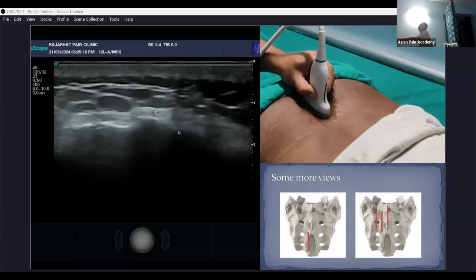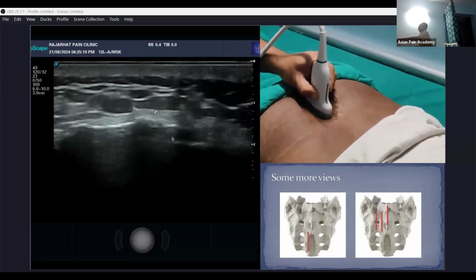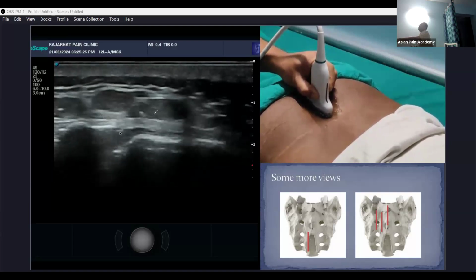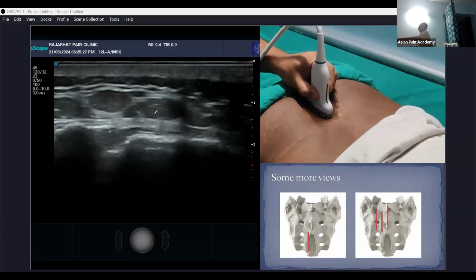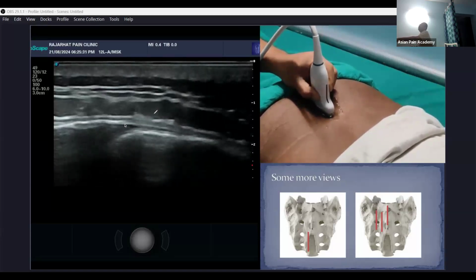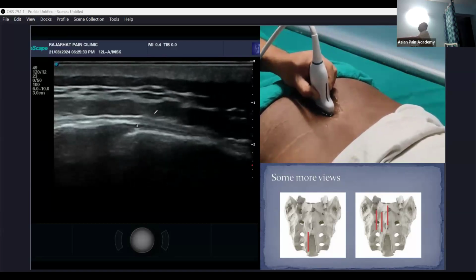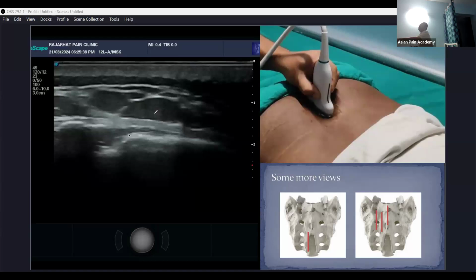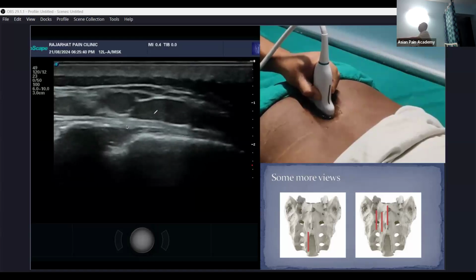So bone is here, also you can see another bone. Here also, this side also you can see another bone. And if you see in the midline, then from here only there is a gap, but if you go to the side, then you see bone comes up to here, and this part is so small. You have to be staying in the midline to get a good access.